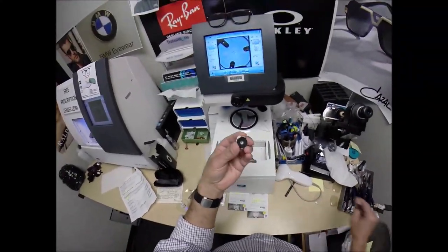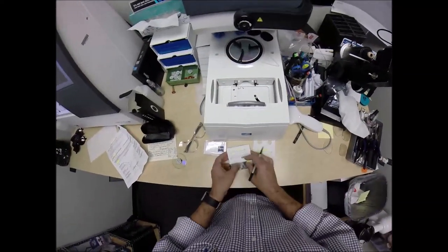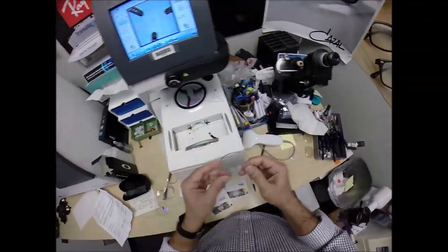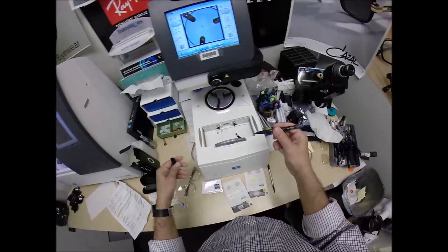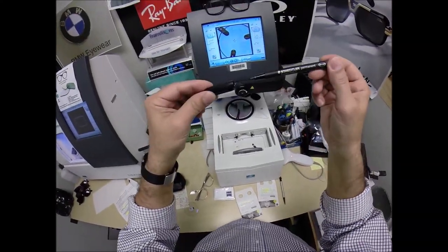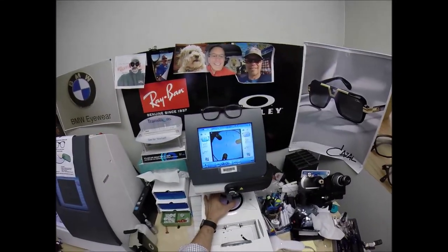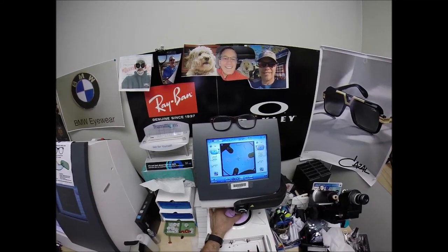Pull the paper away to make the black side sticky. Line up the magnet. Grab your left lens out of the package. And had this not already previously been marked left, I would mark that. And the only reason I did that is so if you guys missed any of that, let me recap. You know I had to sneak that in. I'm not letting you get away without a bad joke. Same pupillary distance, same optical center height.